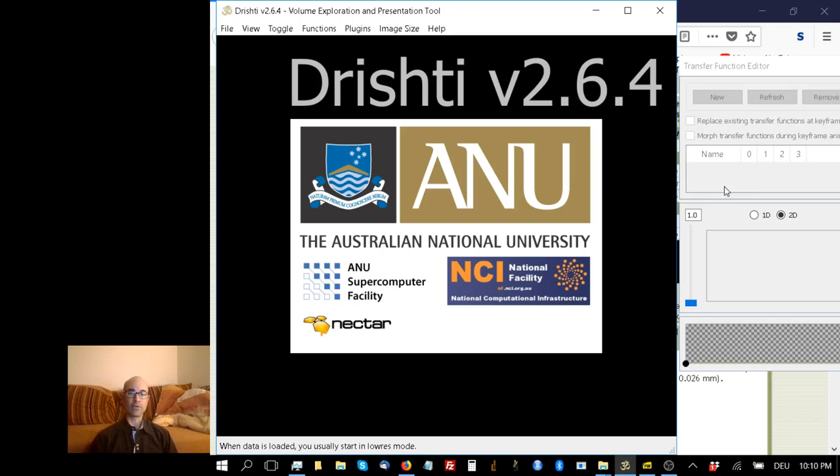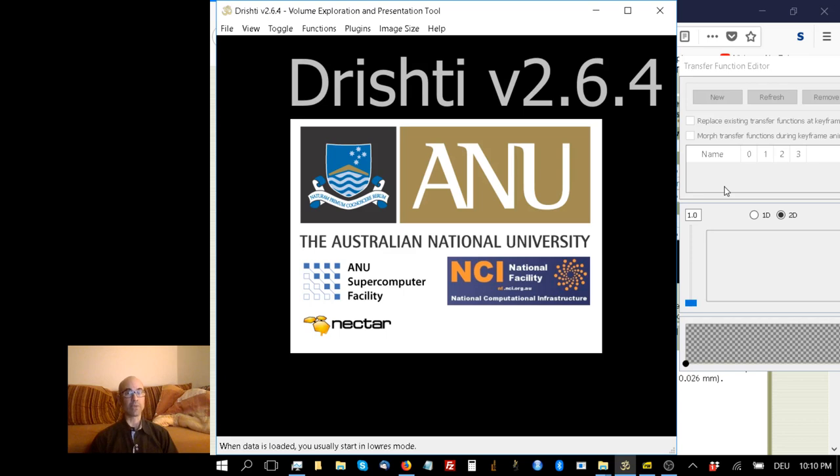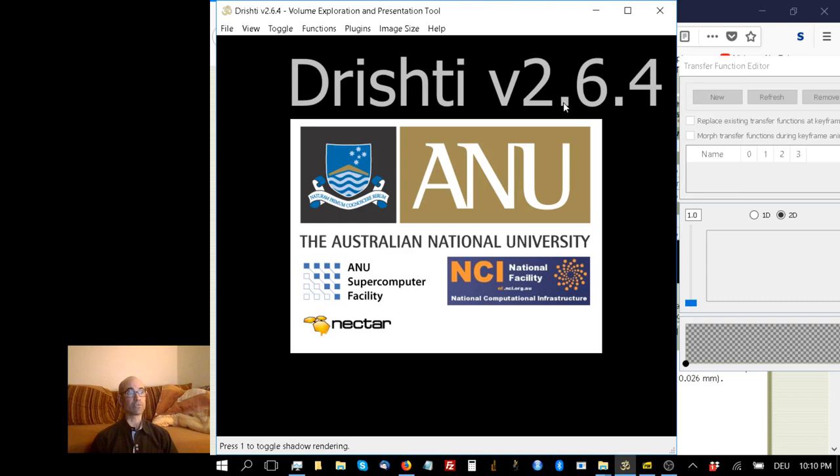Hi there. In this video, I'd like to show you how to use Drishti to make good quality images. We've talked already about Drishti Import and Drishti Paint, and here's the main program, Drishti itself. Again, it's version 2.6.4.